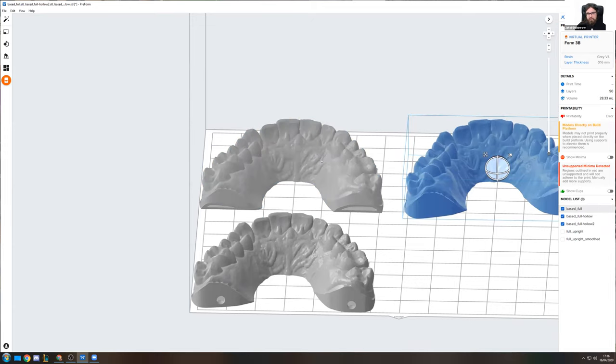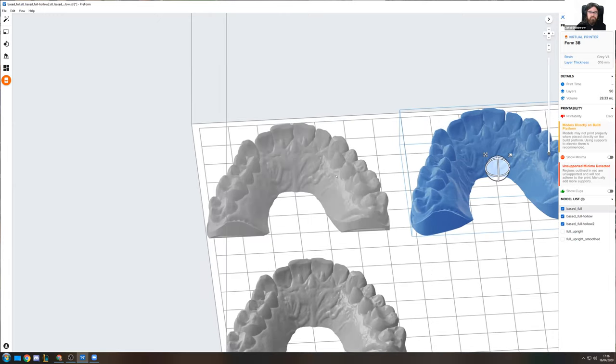And one thing you have to remember though, if you're printing hollow models, as we're dipping these models, we're gonna look at that in a minute. As we're dipping these hollow models back into the liquid resin again and again during the printing process, there's an effect that can happen, which is a so-called suction cup. Imagine you take your teacup and you want to rinse it out in a bowl of water and you push it in, then you would feel the same thing, where it basically pushes back. And we have to solve that suction cup issue right here.